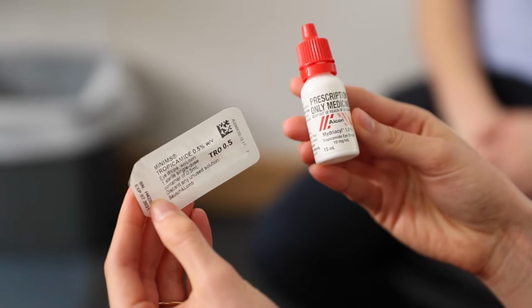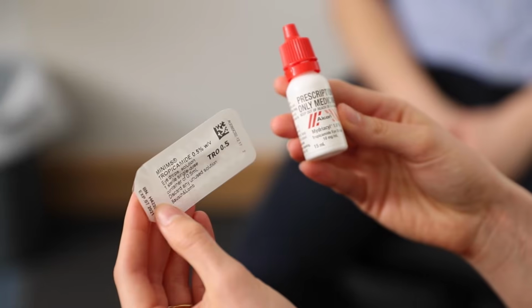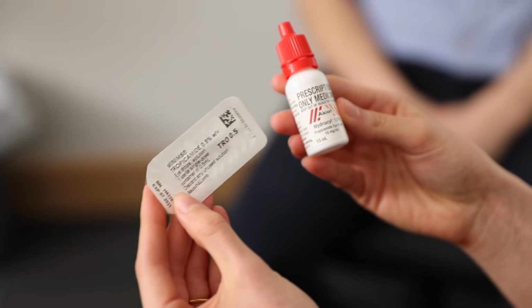Next, you want to dilate the patient's pupils with mydriatic drops, because fundoscopy through undilated pupils can be difficult. A short-acting mydriatic drop, such as tropicamide 0.5% or 1%, is ideal for this. Prior to dilation, examine the pupil reflexes as well as visual acuity and visual fields, because you won't be able to do this properly once the pupils are dilated.